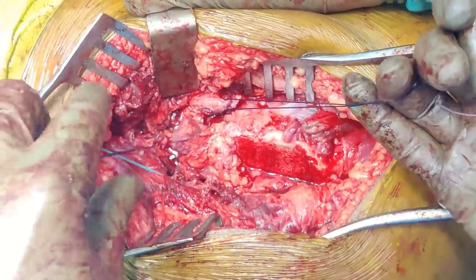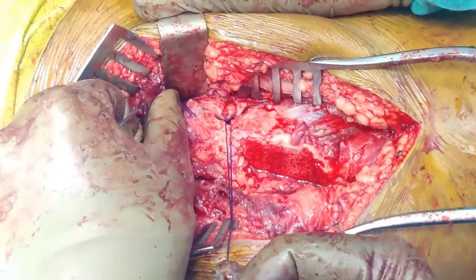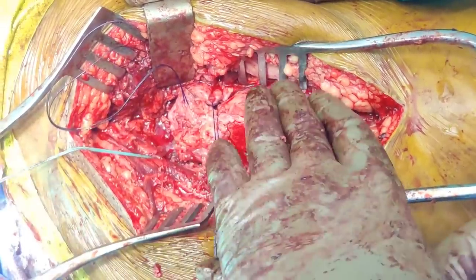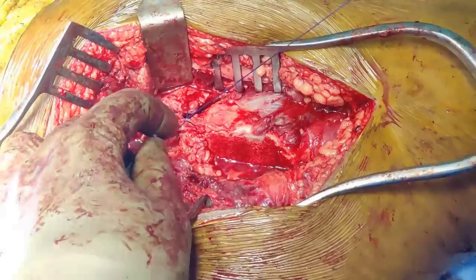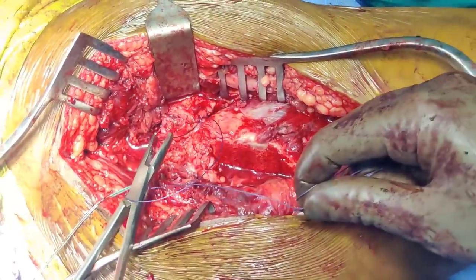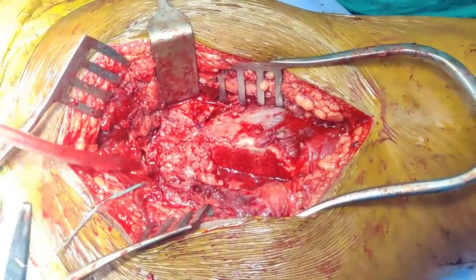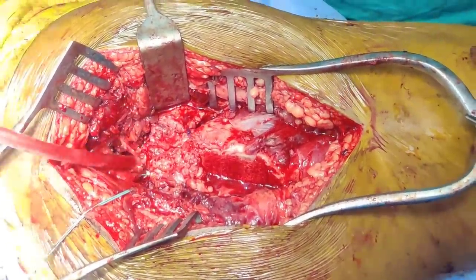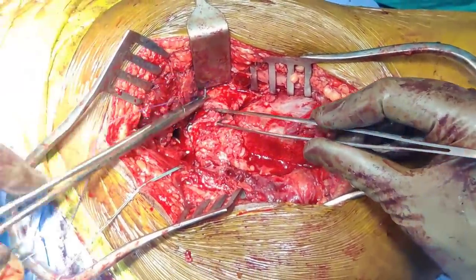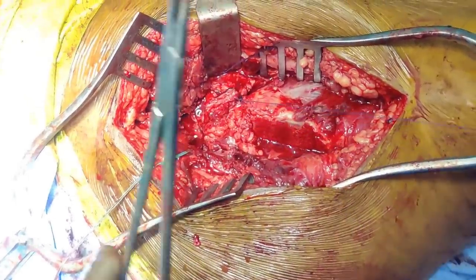We have done everything that we need to do — the hip is reduced and we have fixed the posterior wall. If you are addressing the posterior wall, do not put the GT back because you may need it as it helps a great deal in having superior access. The first thing we do is tighten the corners. Take number one vicryl, do the inferior corner first, then suture the superior corner, and then put some interrupted sutures.